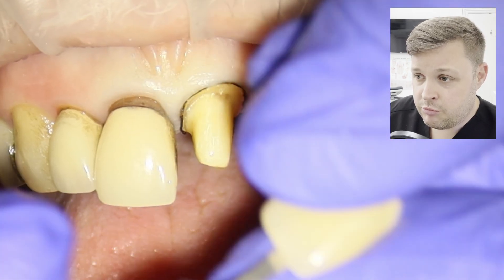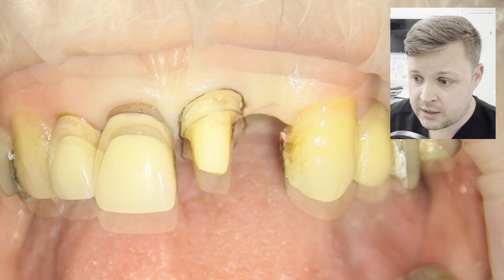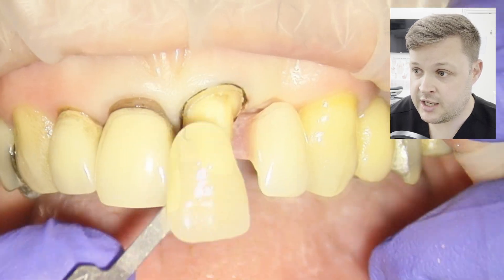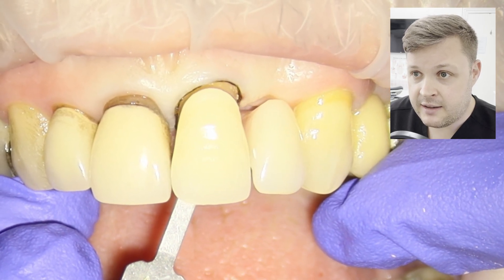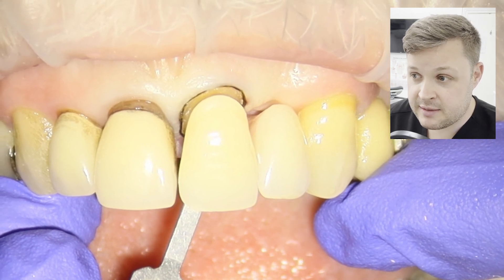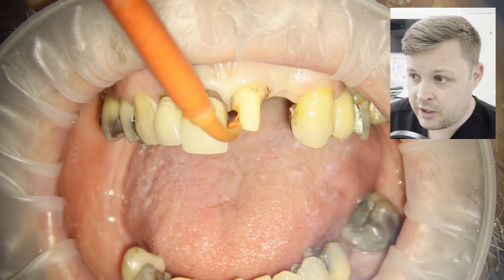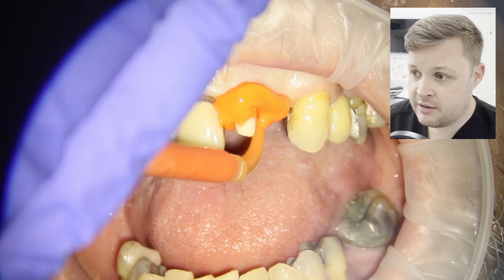Next is choosing a colour — really really tough. Usually I choose a few shades I like and then show the patient those shades. Here I'm also checking the shade with the denture in, and the patient likes the shade of the denture. We're going to wait a couple of minutes and then remove the retraction cord.